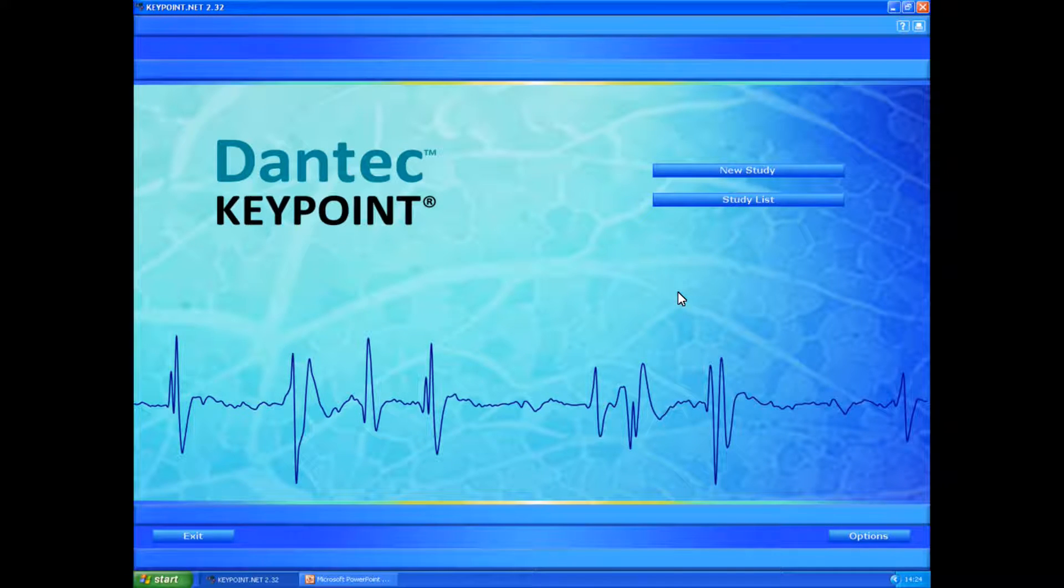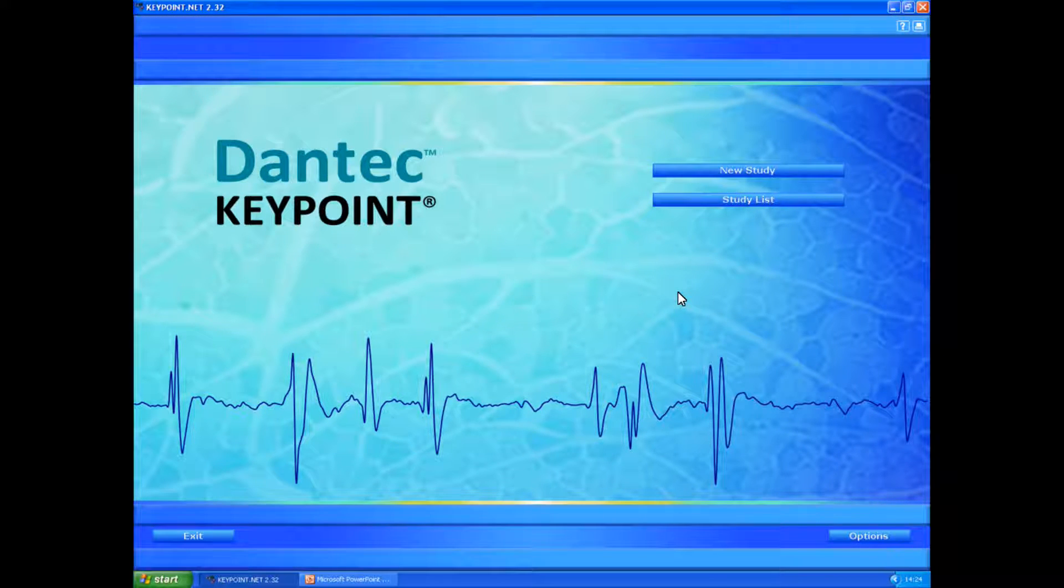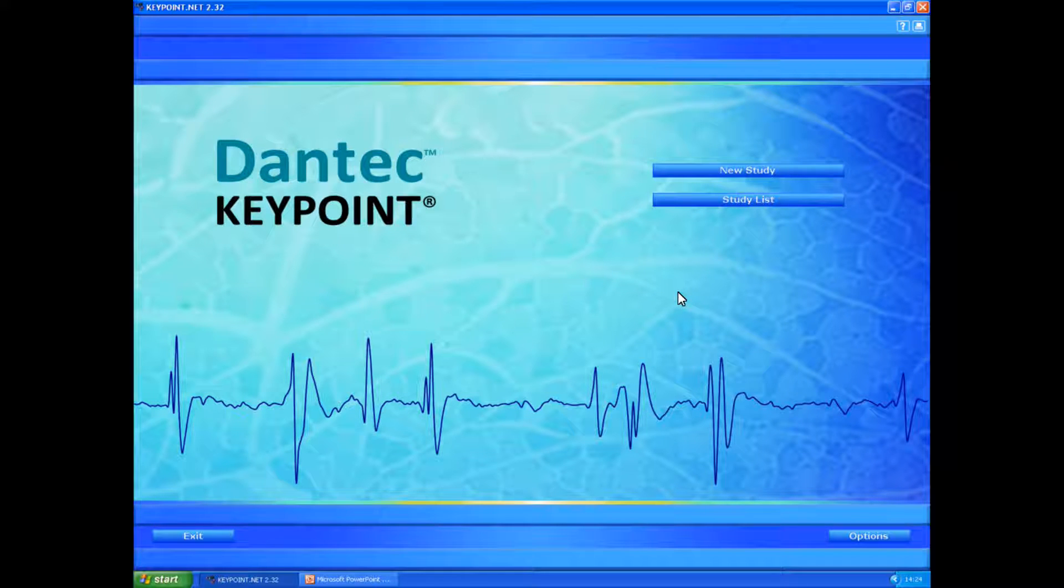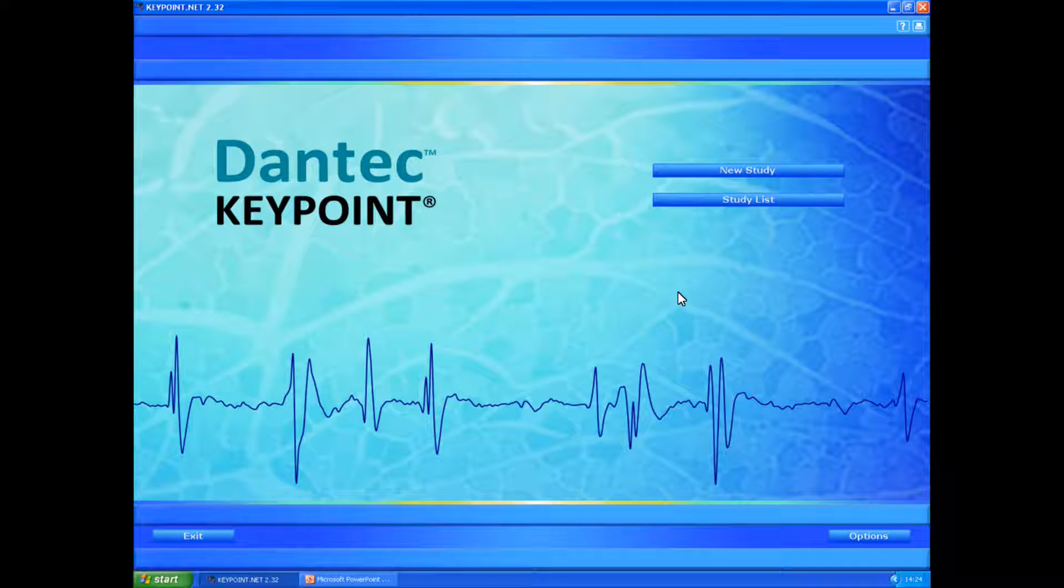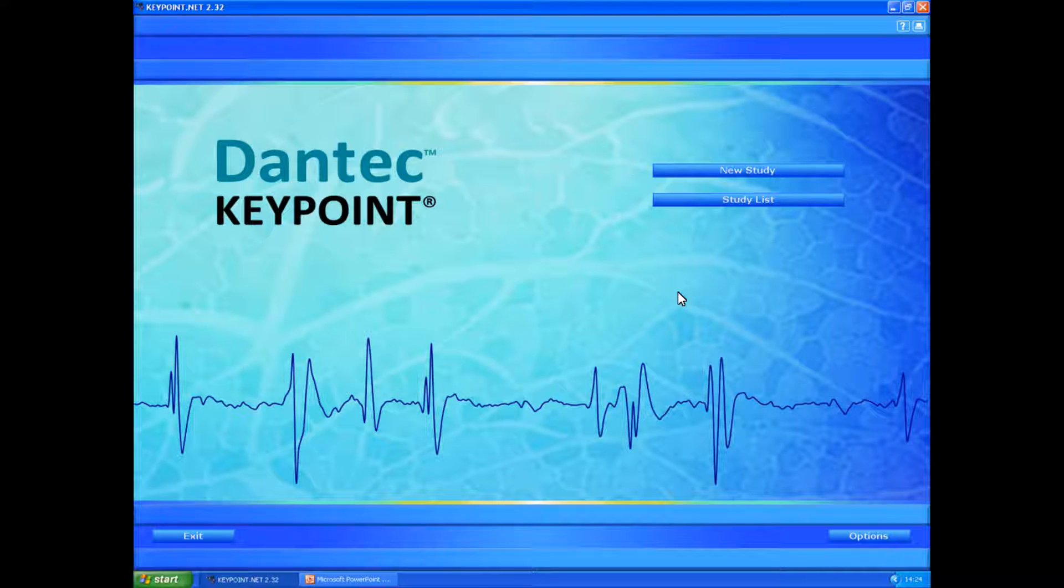My name is Dr. Simon Fryley, a consultant in clinical neurophysiology. I was recently asked by one of the viewers to explain how we set up protocols in the Dantec KeyPoint.net system. This is how it's done.